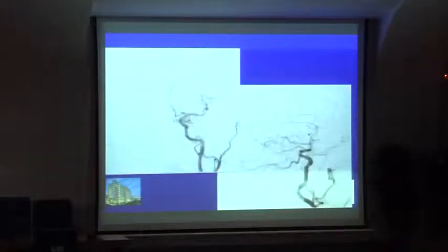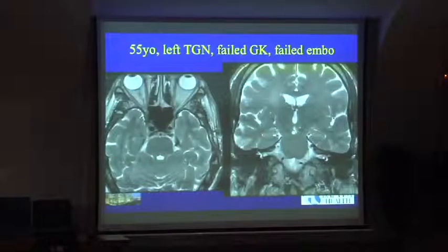And that's the post-op. External, internal injection, the whole fistula is obliterated. Here you see another case. This gentleman had been struggling, going to a bunch of different places.